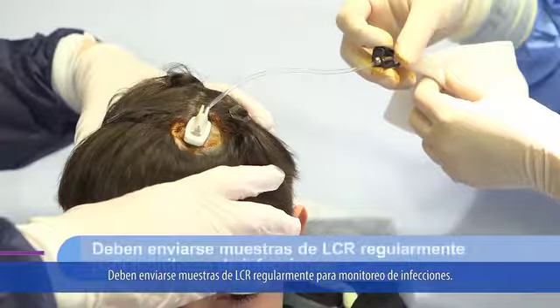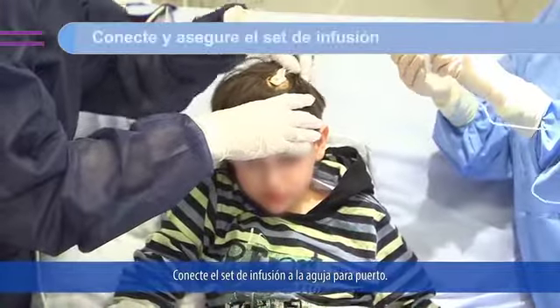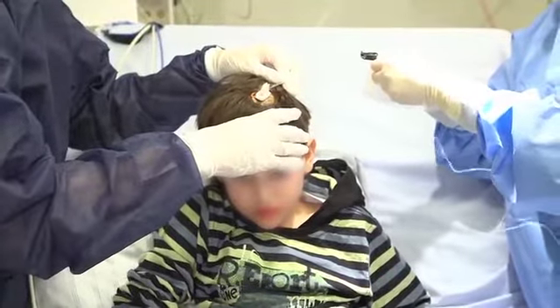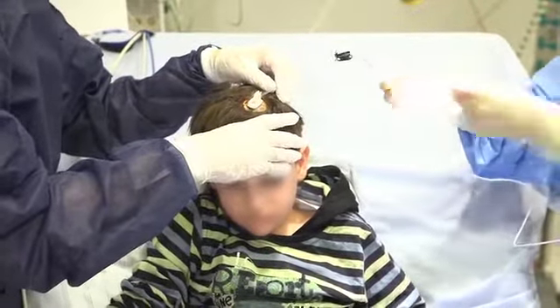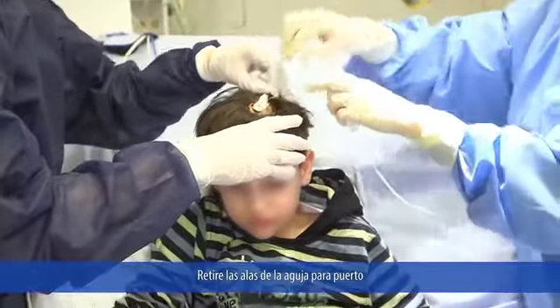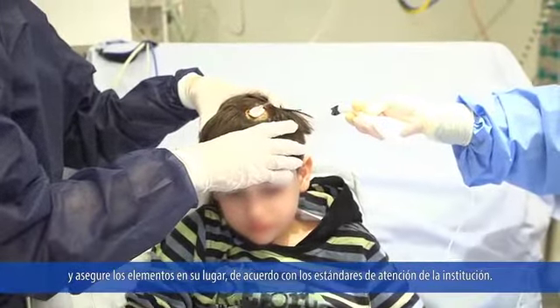CSF samples should routinely be sent for infection monitoring. Do not return cerebrospinal fluid to the access device. Attach the infusion set to the port needle. Remove the gripper wings from the port needle and secure the components in place as per your institution's standard of care.